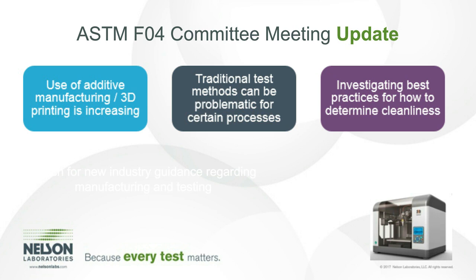And so at this point, the FDA and other labs are investigating alternative test methods, or what is the best test method to look for these types of residuals, because ultrasonic is used in many different test methods to look for surface residual cleanliness, which is what we're talking about, and that is looking like it's not appropriate for certain additive manufacturing and 3D printed devices.